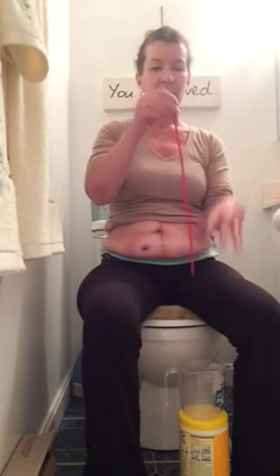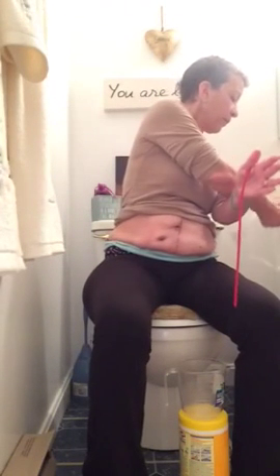Today I'm using an alcohol swab. I swab with one side of it. I take the catheter. This is a 16 French. They come in all different sizes. The French is a way to measure how big the little hole at the end is. They come clear, they come red, they come curved, depending on what's best for you. I put a little lube on my finger. You have to lube the catheter so that it doesn't injure the tender tissue of the stoma and the pouch, because they're made of intestine.